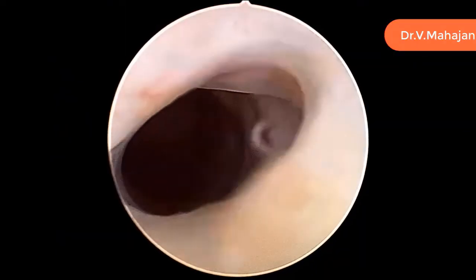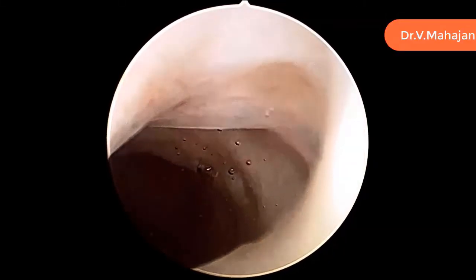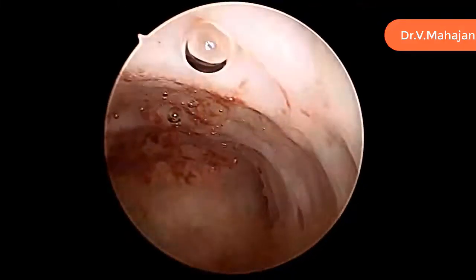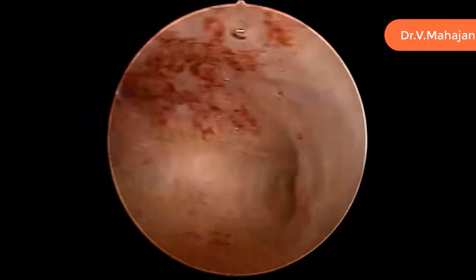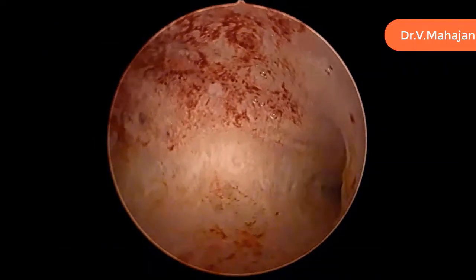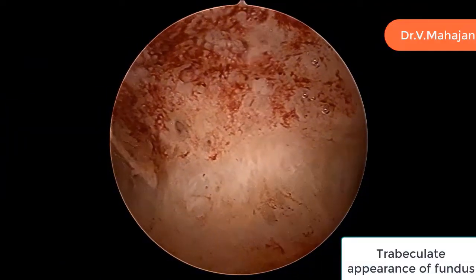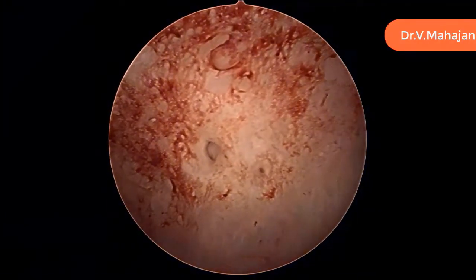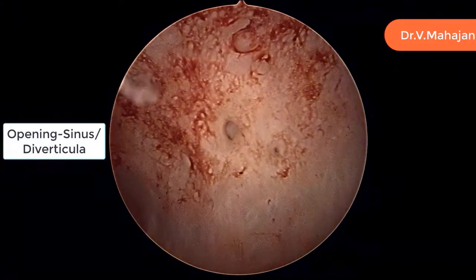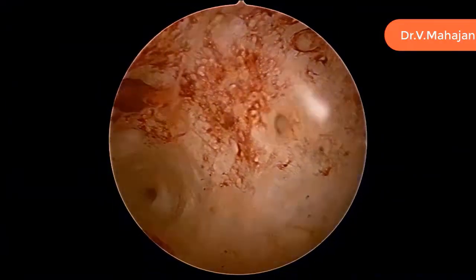All these findings are suggestive of adenomyosis, though they are not diagnostic of adenomyosis. As we enter the uterine cavity, you can see the irregular surface and the hyperemic endometrium with strawberry appearance and dilated white spots — those are the endometrial glands. In the center you can see the hypertrophic muscular column giving a trabeculate appearance of the fundus. The holes visible are suggestive of adenomyosis, representing invasion of the endometrial glands and stroma into the myometrium; these are also called sinuses and diverticula.